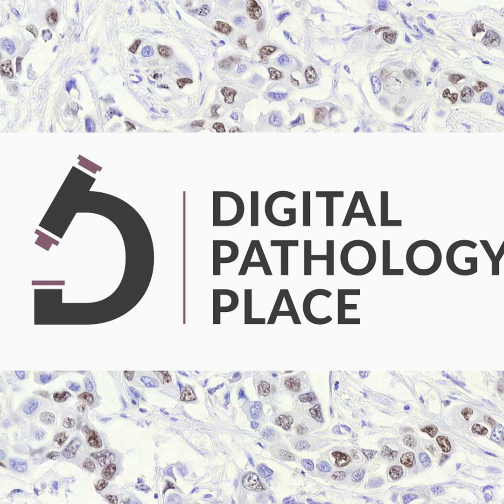Yes. And then we return the slides and either give them the digital slides on some type of media or over the internet with an FTP server or something like that. So they end up with the glass slides back and the virtual slides. So you mentioned the NDP Serve. This is something that can be used for televiewing, if I understood correctly. Yes.